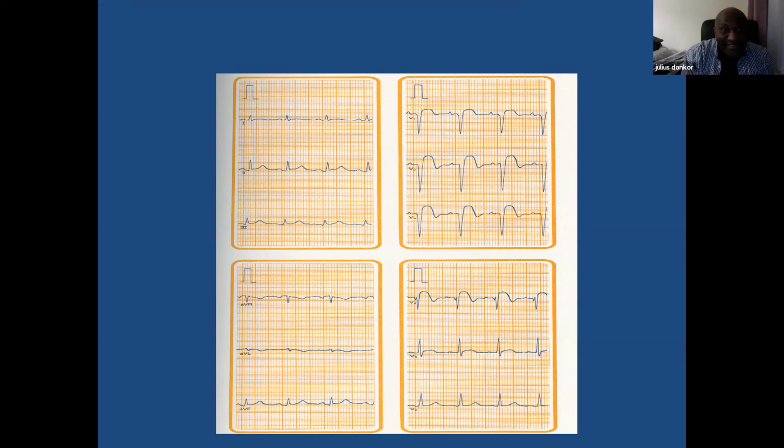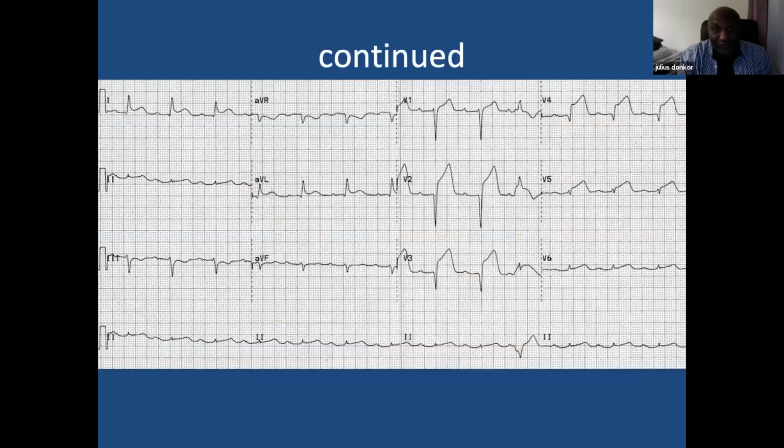slight reciprocal changes there. It's not so good in this one. I remember when I was showing it, it wasn't so good, but you can clearly see in other ones that are coming, you should see a reciprocal change in your inferior leads. So this is an anterior MI.